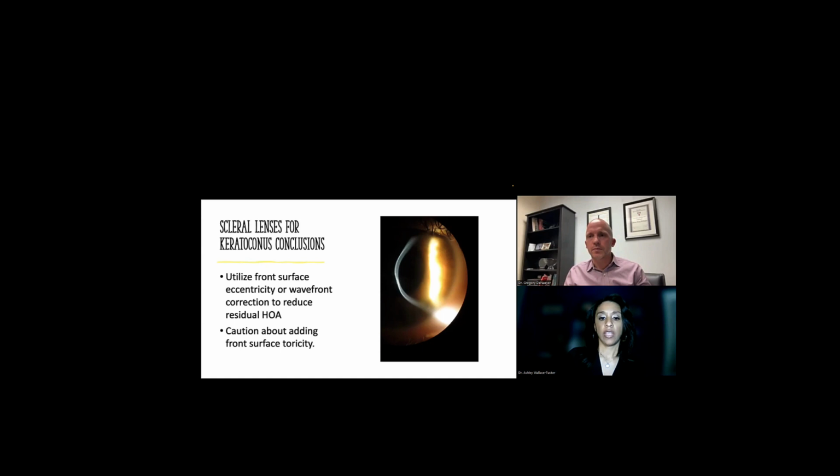Okay. I have a listener that would like to know, how do you know specifically when to add eccentricity or wavefront to correct spherical aberration? Yeah, if you have an aberrometer, you can look at the residuals, combined with their visual acuity, if they're performing maybe like you wouldn't expect, considering the rest of their eye, they don't have corneal scarring or their eyes are healthy. But again, as I mentioned, you don't have to have an aberrometer.